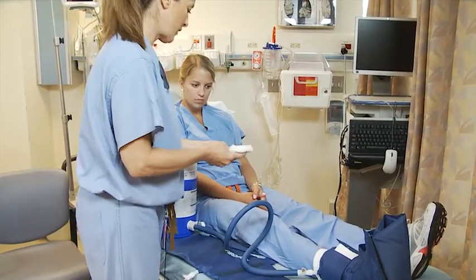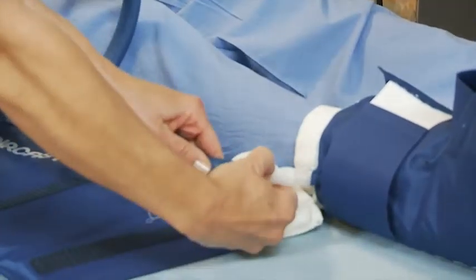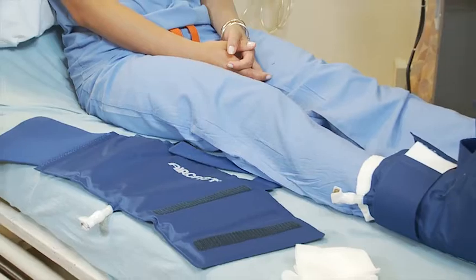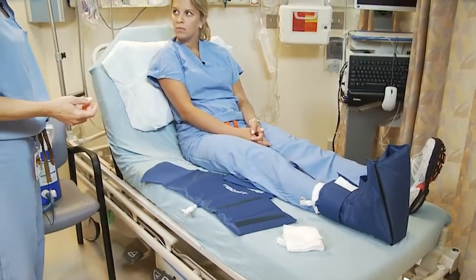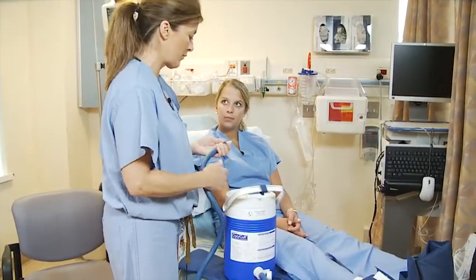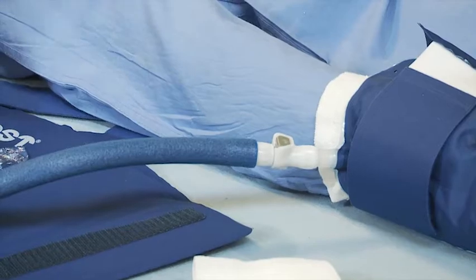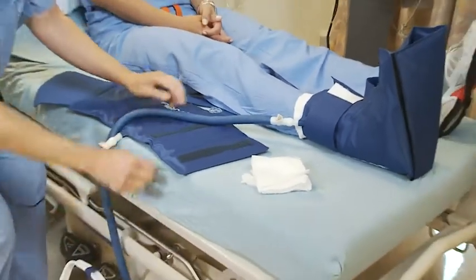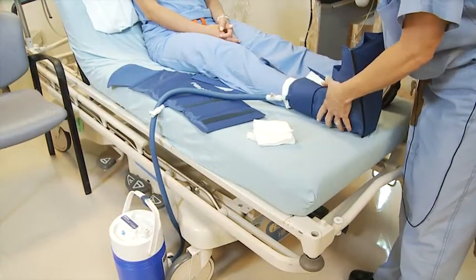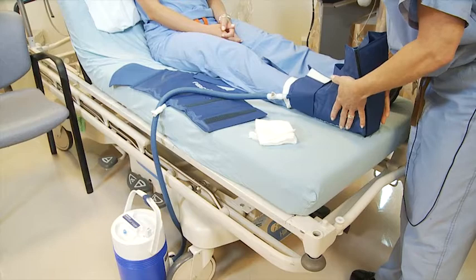To disconnect, I would advise using a face cloth or some paper towel because it drips out icy cold water. Depress this little silver disc and then shake out the icy cold water and put the cooler to the side. So after about 30 minutes or an hour, you can come back and exchange. You want to just make sure there's a good amount of ice in there. If there isn't, just drain out some of the water and fill it with ice. Reconnect, lift the air vent, and lower this below the level of the foot. The warmed water now goes back into the icy cold cooler. It's just an exchange of water.